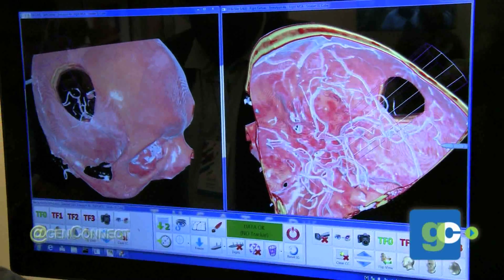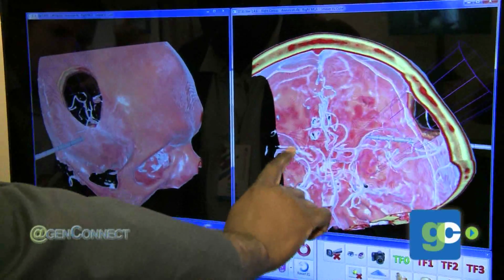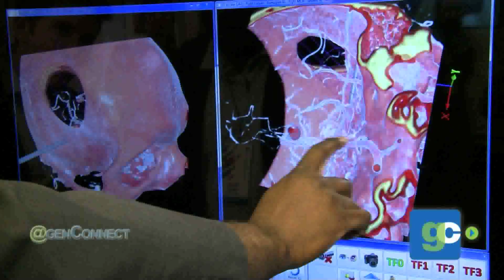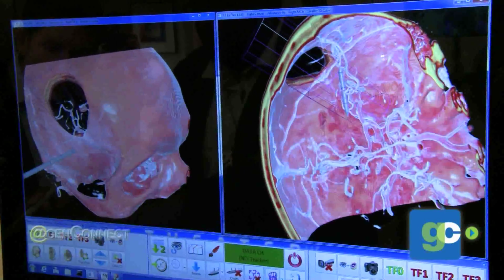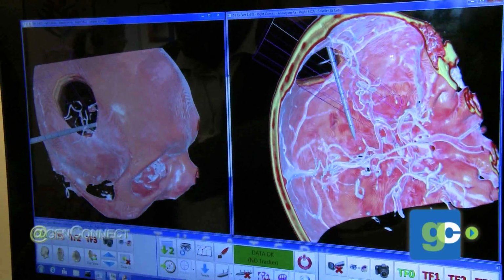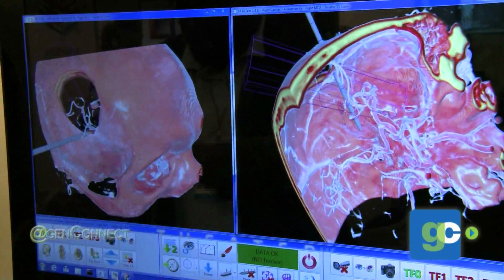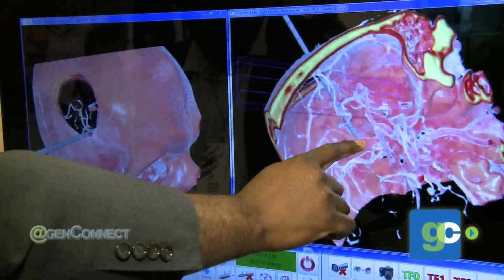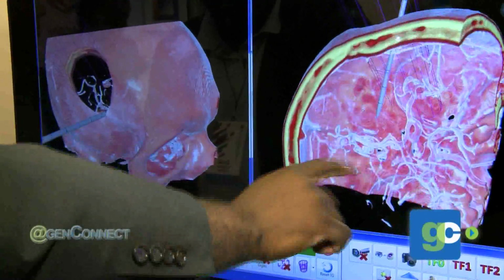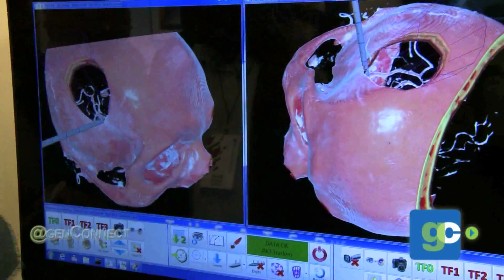So if you pretend that this is a tool or device or navigation tool that the patient is right here, right? This is the patient's right here, and you wanted to know the structure that you're pointing at, how it relates to other structures in the brain. You basically could see how this is then represented in a three-dimensional form. The tip of the tool, where it is represented, and you could see the objects that would be close to the area of the object that you're pointing to.